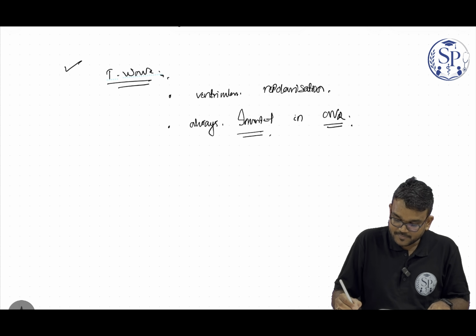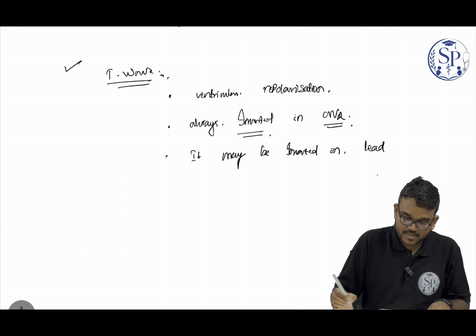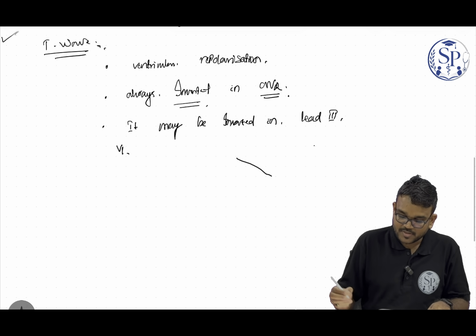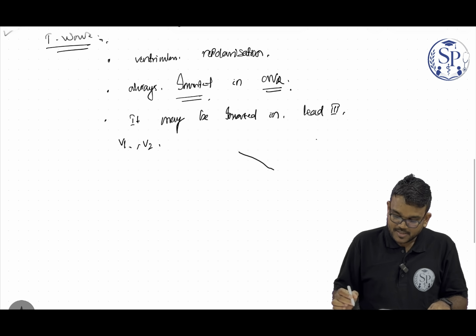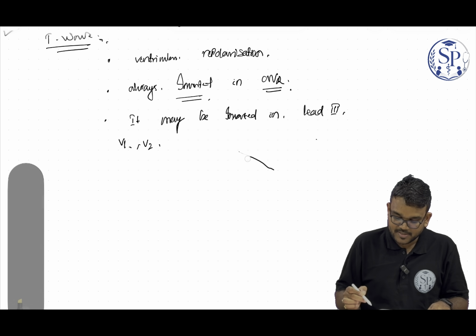It may be inverted in lead 3, lead V1 and lead V2.